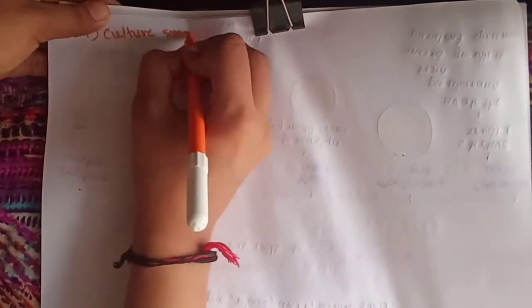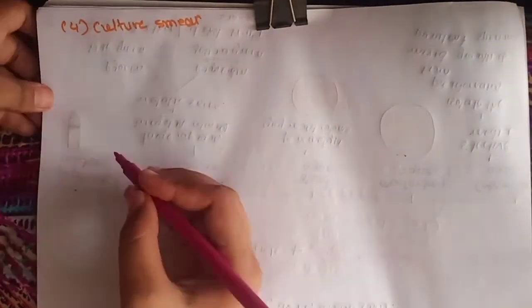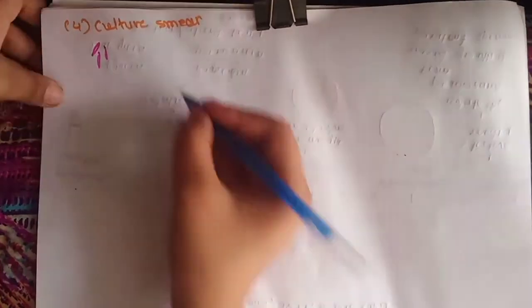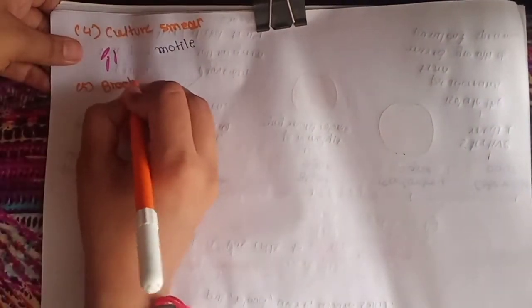The fourth method is culture smear microscopy. In culture smear microscopy, we will see gram-negative pink colored bacilli and actively motile bacilli.